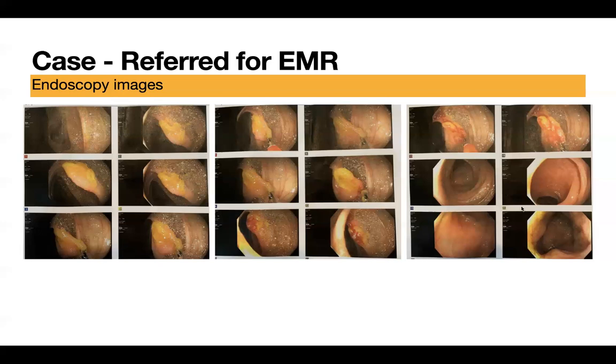The lesion is slightly elevated. The margins are slightly irregular, and it looks to be large, like more than 2 centimeters, about 2.5.